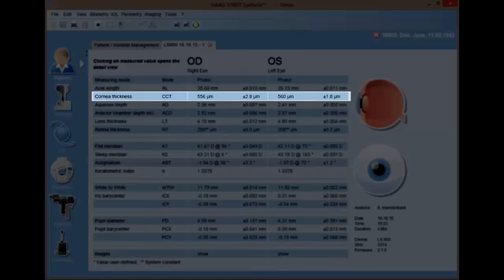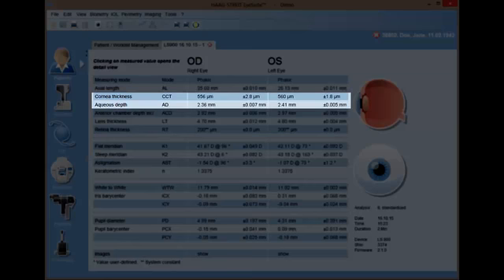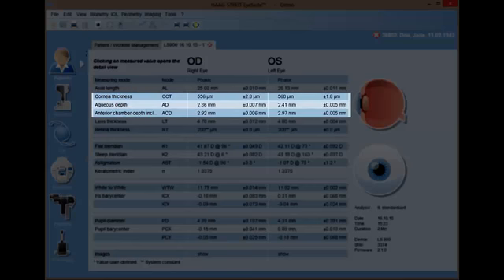For IOL calculations, CCT and AD are combined to provide the user ACD anterior chamber depth.